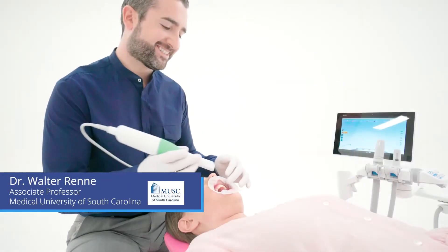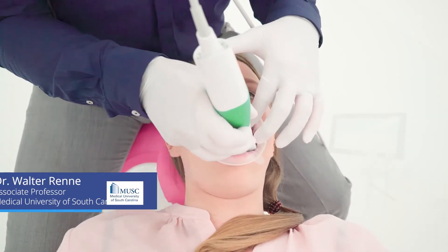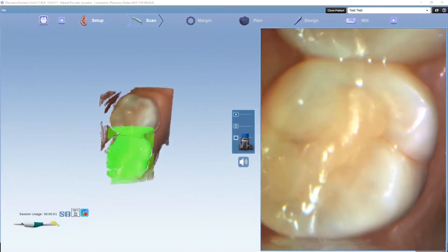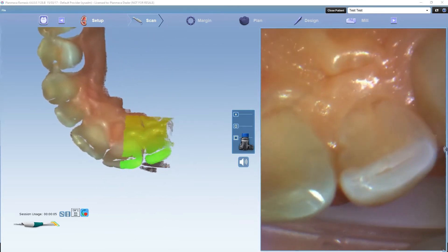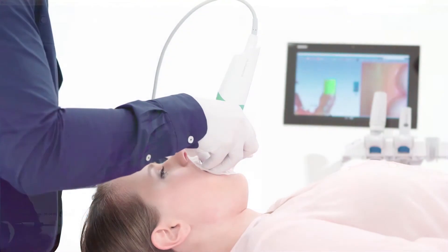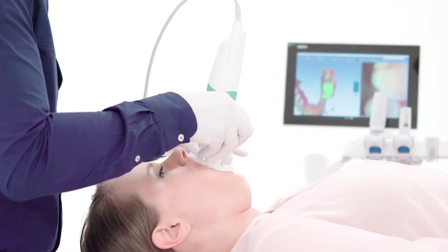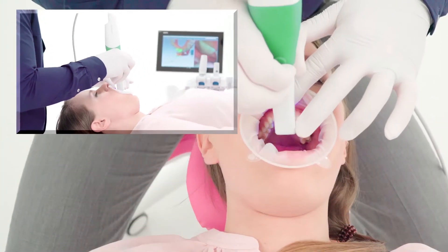The Emerald is your full arch workhorse scanner, whereas the plan scan I really liked for quadrants and things like that. I feel like the Emerald is designed from the ground up for full arch scanning, and it does it remarkably well. It's very fast and lightweight — you wouldn't think weight is a big thing, but when you pick it up it's as if you're holding nothing.